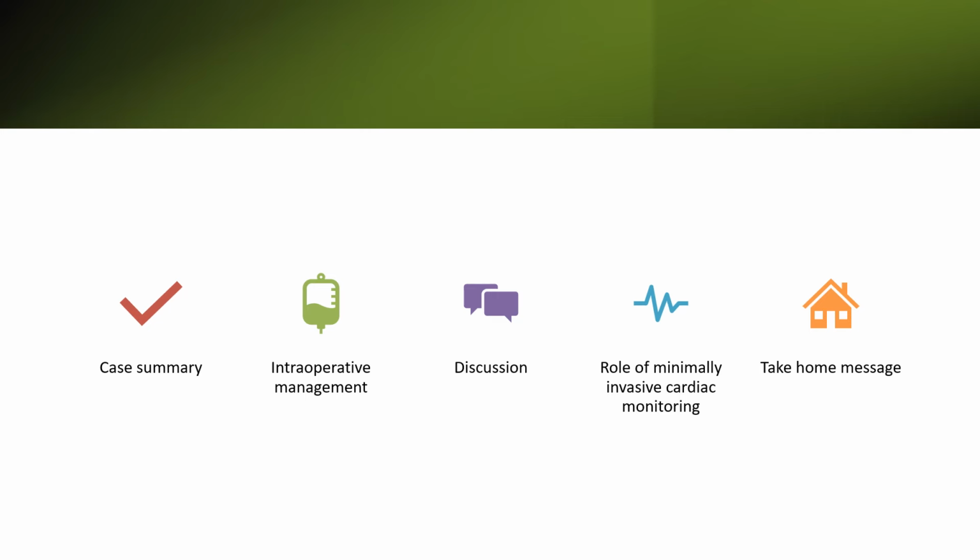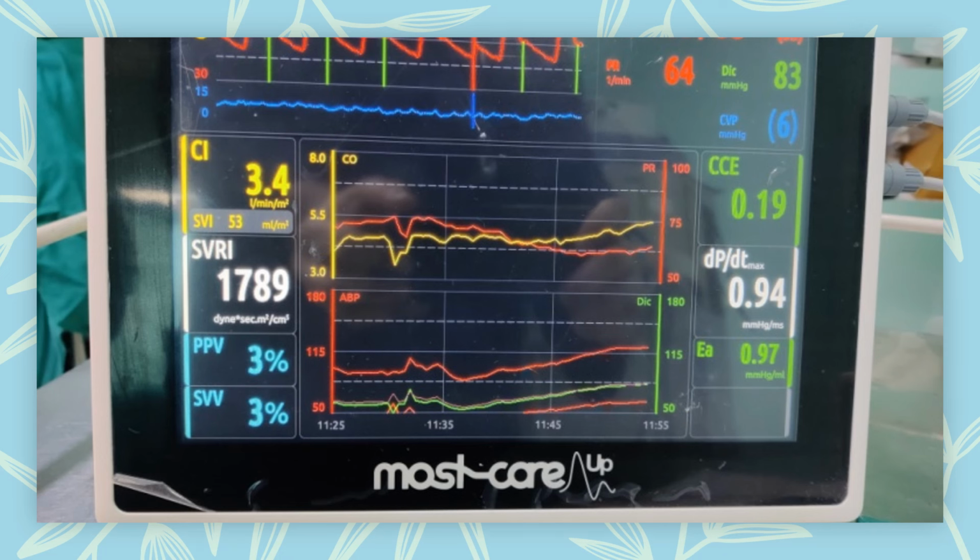Now, why I always like to incorporate a case-based discussion in my lectures is that I want active learning and active participation from the audience as well. So I can teach you the old-fashioned way, the ones you have been getting knowledge from, such as CMEs and conferences or some YouTube pages, where I just tell you what these parameters are. I'll show you the monitor screen and tell you this is cardiac index, this is SVRI, this is SVV, this is EA-dyne, this is dP/dt, and move forward. And finally give you one algorithm to take home and take a screenshot of, which you will never see.